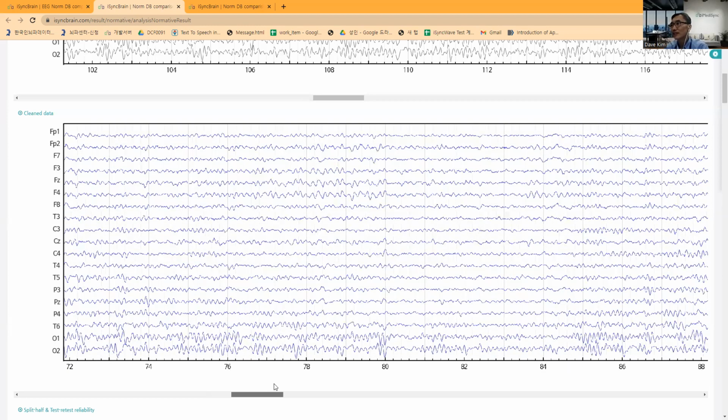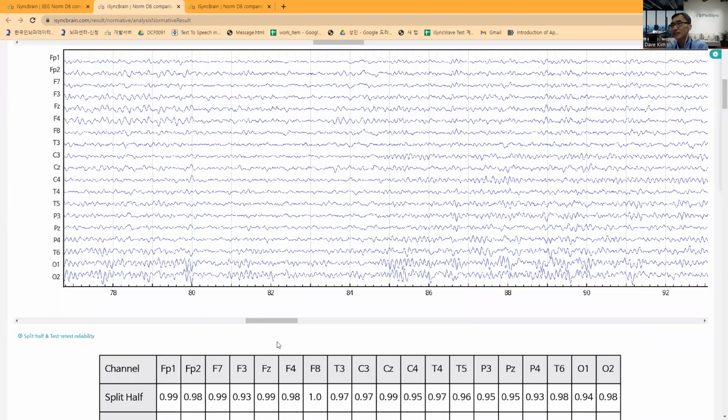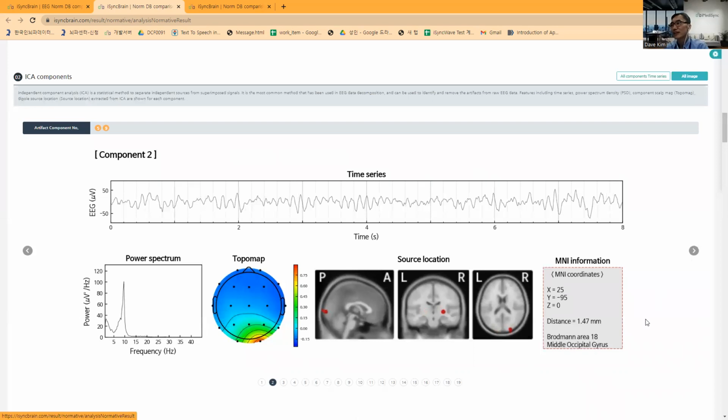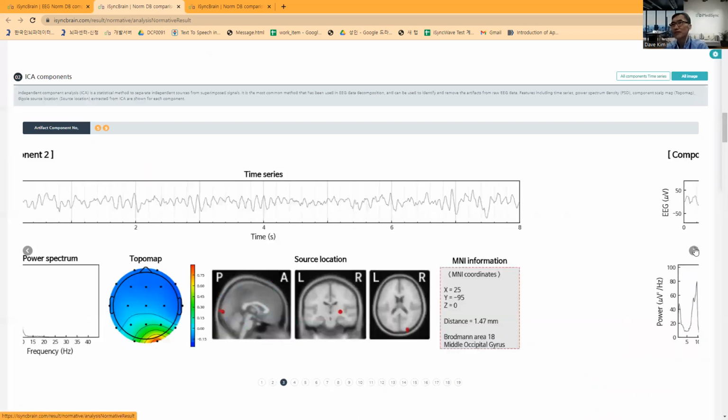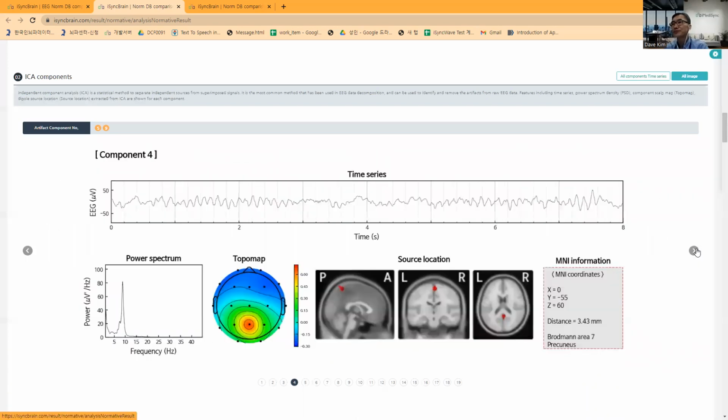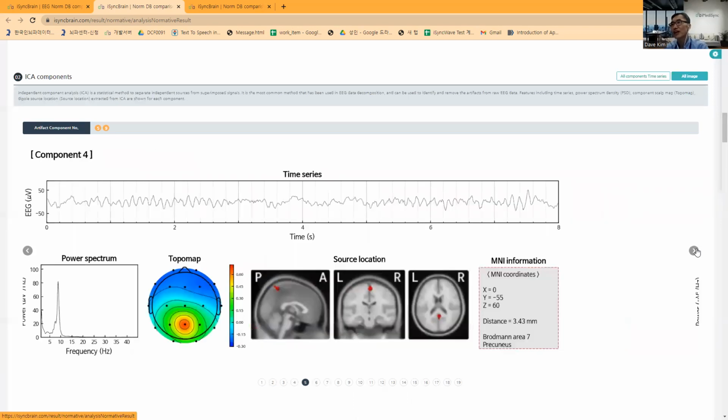This is the raw data of this ADHD patient, and we can see the components. The first component, basically 19 components, usually in the order of power. The first component is the major component in his brain activity. The first component comes from the lingual area, generating normal alpha rhythm. The second is another occipital generated alpha rhythm. And the third is an alpha rhythm too. And the fourth activity is precuneus generated alpha activity.